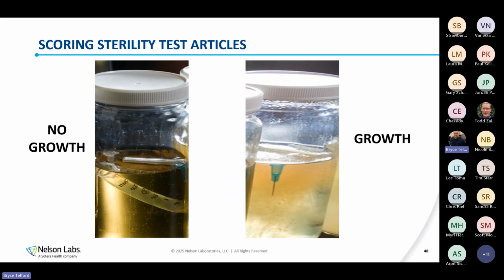So for example, maybe I have a syringe, such as is pictured here. So I might only claim the fluid pathway for the syringe and needle as sterile. So we would generally do sterility testing just on that portion. But the ISO 11737-2 sterility standard as it's revised has some additional requirements in it that make that problematic to the point where we really can't do it.